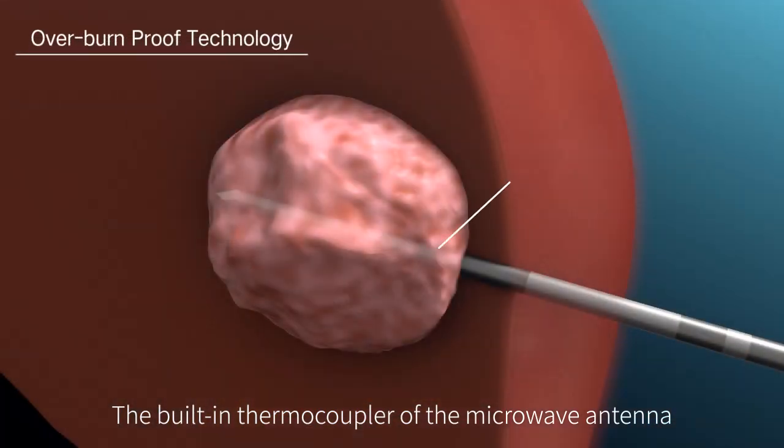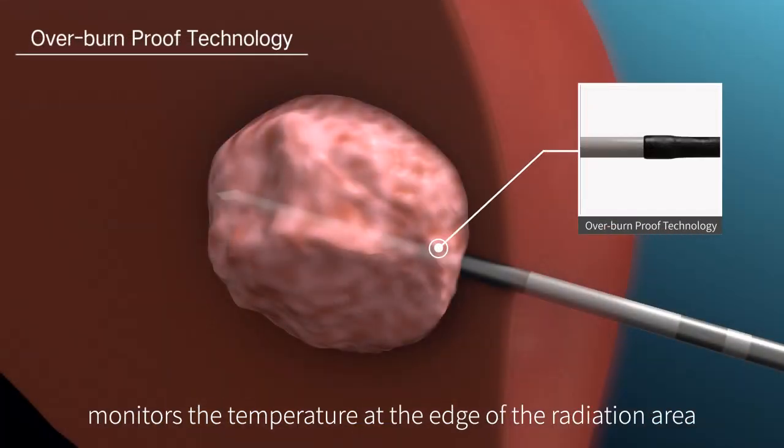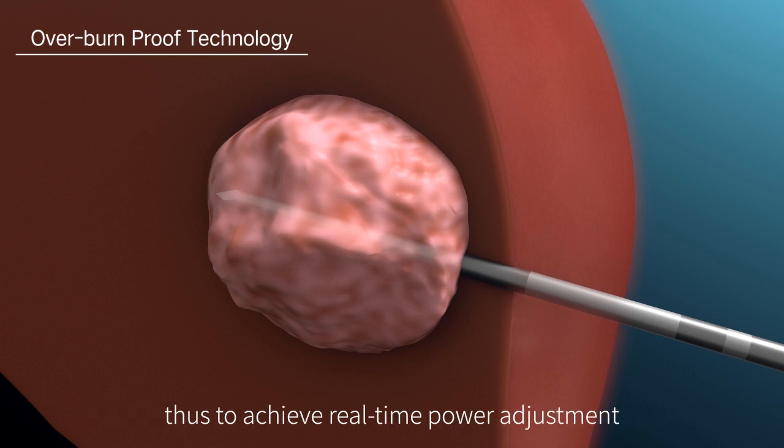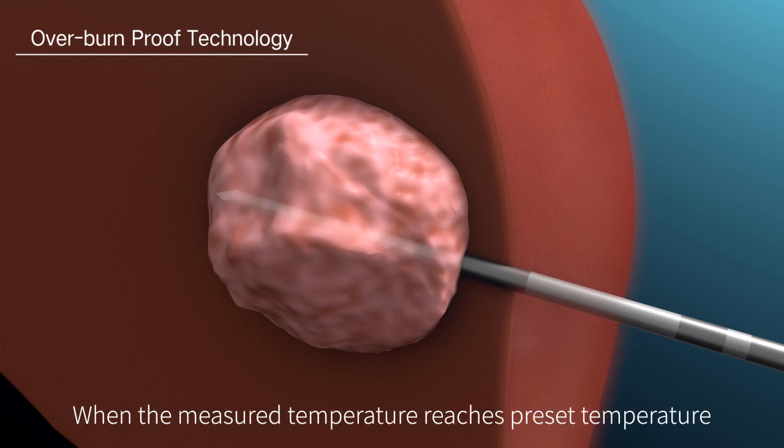The built-in thermocoupler of the microwave antenna monitors the temperature at the edge of the radiation area to achieve real-time power adjustment. When the measured temperature reaches preset temperature, the power is automatically adjusted.